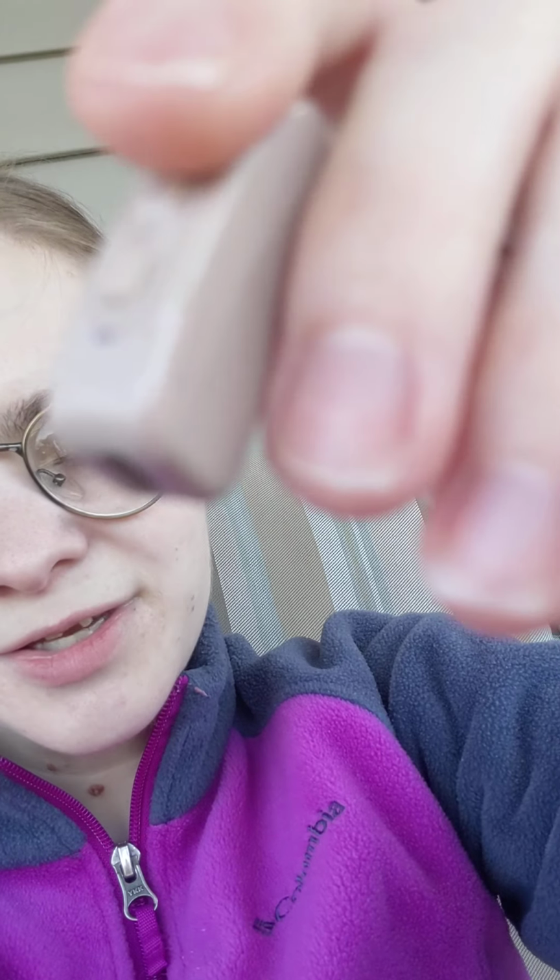This is the actual hearing aid. Yeah. So, I like it a lot. And this back part is where the plug goes in. And these are the buttons. And it beeps twice when you turn it off. So yeah, here's the hearing aid. I'm going to put it back in now. Sorry, I almost dropped it. Not on the ground, just almost on my hand. And so I showed you that the best I could. I hope you got a good enough picture of that. I didn't mean to get it too close, but I was trying not to drop it as well as show you.